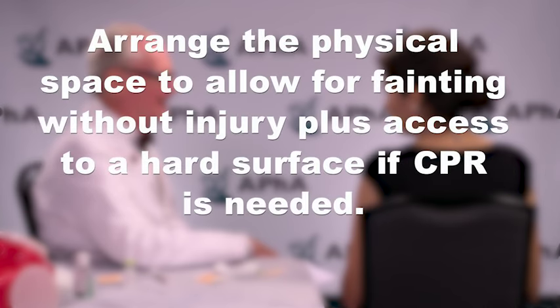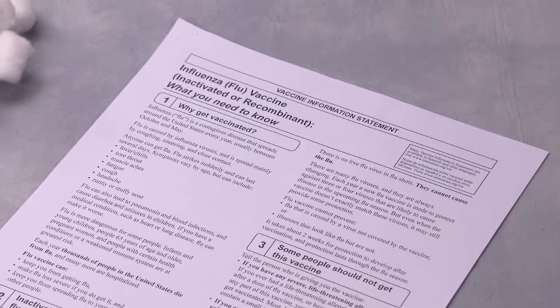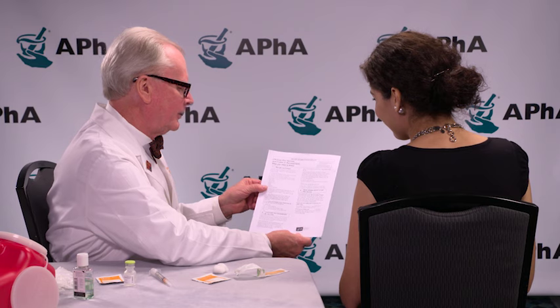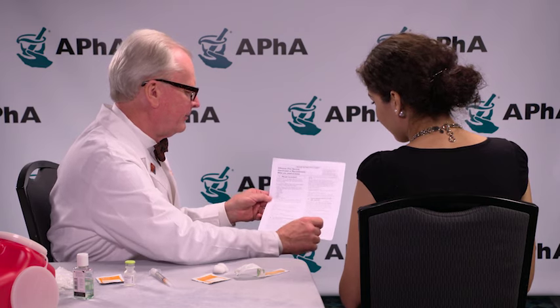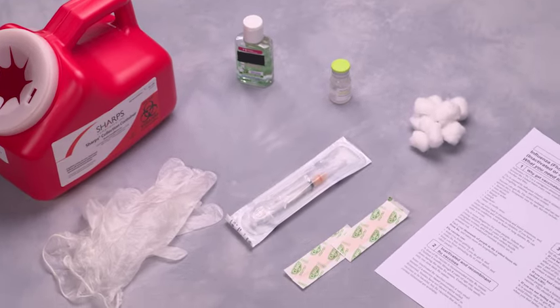Arrange the physical space to allow for fainting without injury, plus access to a hard surface if CPR is needed. Provide your patient with a current vaccine information sheet (VIS) as required by law, and review any applicable screening questions and updated information with the patient. Ask the patient if she or he has any questions about the immunization. You are now ready to prepare your syringe and patient for injection.